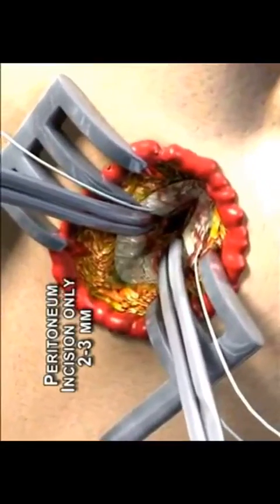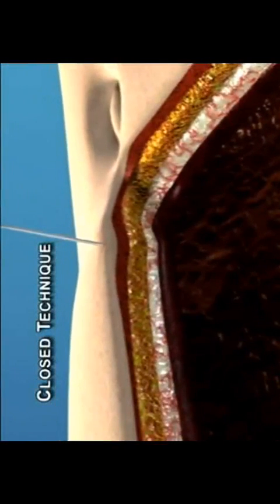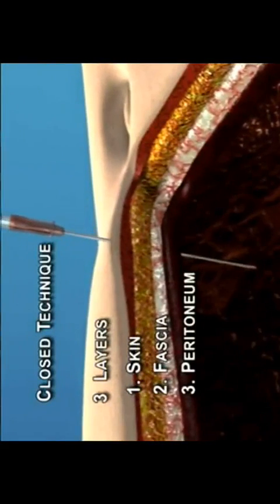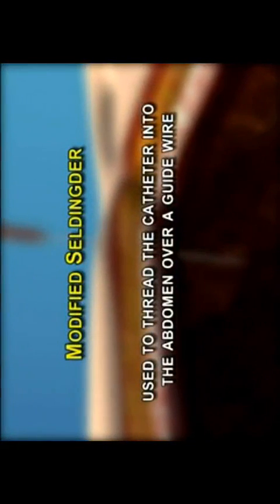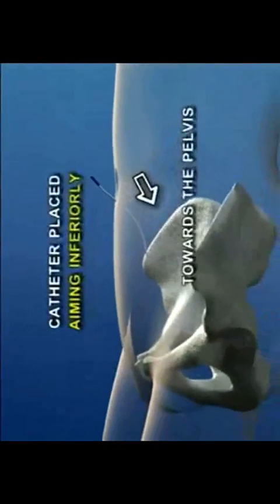2 to 3 millimeters. Note, the closed technique uses an introducer needle to penetrate the 3 layers of skin, fascia, and the peritoneum. The modified Seldinger technique is then used to thread the catheter into the abdomen over the guide wire. The peritoneal lavage catheter is then placed into the abdomen, aiming inferiorly towards the pelvis.